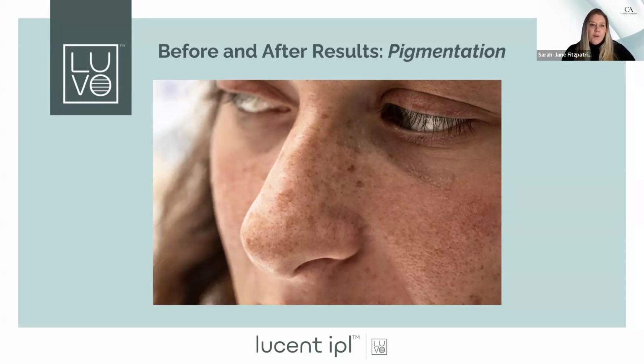I will get to the other two questions I'm not going to ask right now, but can the 755 be used for collagen stimulation? Well, anytime you put energy into the skin, you can use it for collagen stimulation. I think it goes to a triple pulse. However, doing a toning pulse with the 640 would probably give you more of that collagen stimulation. But if you want to go deeper, to the 755, yes, you could do it just for that if you wanted to.